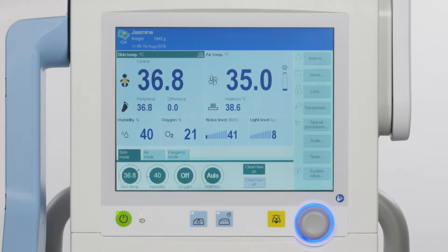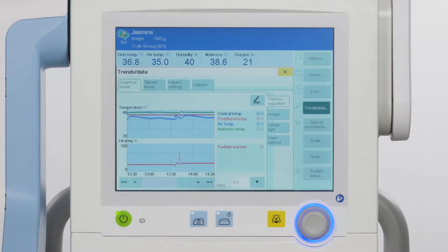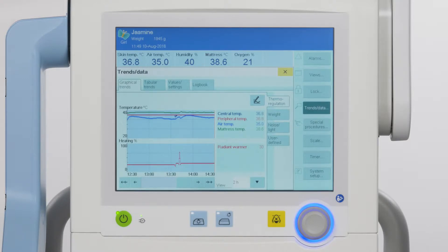Baby Leo allows you to display the patient's trends and data over a period of up to seven days. To view this, touch the trends data button on the main menu bar to open the graphical and tabular trend overview. The graphical trends tab provides a temporal resolution of the display with a selection of different parameter groups.